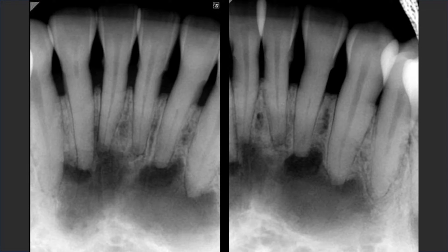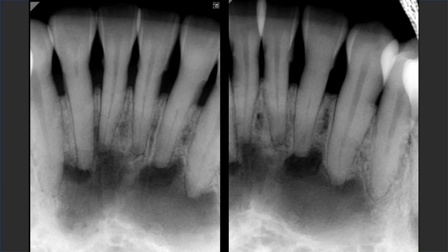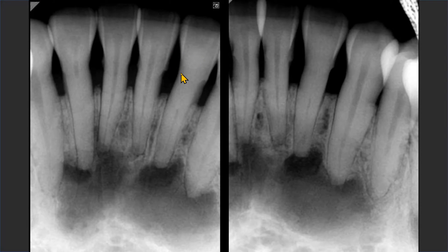We have two periapical radiographs of the mandibular anterior region. The alveolar bone has receded, and there are some calculus deposits, but no signs of carious lesions. These teeth responded positively to vitality tests. The mandibular anterior regions show well-defined radiolucent areas that may look like apical periodontitis or even a radicular cyst. Look for radiographic findings of the lamina dura, signs of carious lesions, or root or crown fracture.